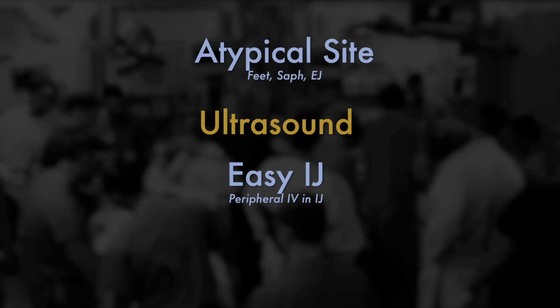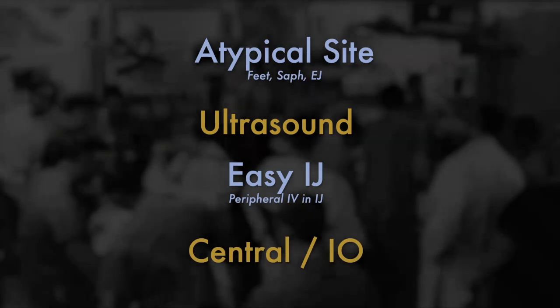It's a great line. And then if all of that fails, head over to the central line, head over to the IO. And of course, you can always reserve the IO if someone is imminently crashing and needs medication right this very second. But if you can get vascular access into the bloodstream, I think most of us would agree that that's a better route.